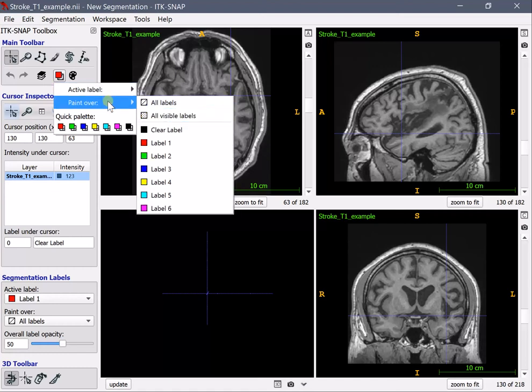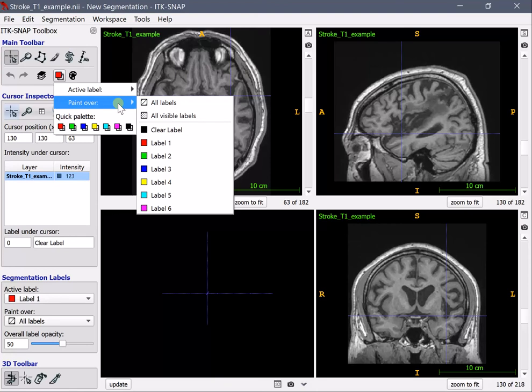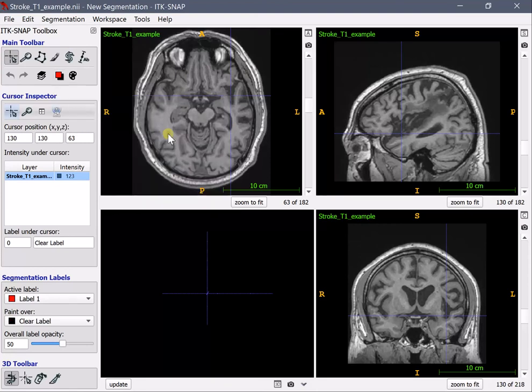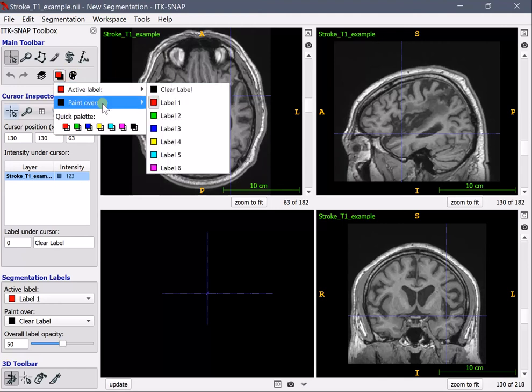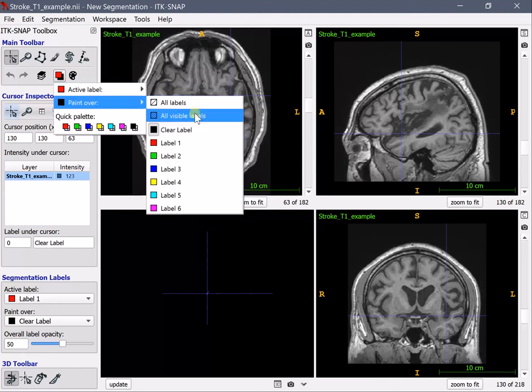The background or the paint over label is very helpful if you do more complex segmentations and allows you to select on which other value you're drawing. For example normally we draw on simply on label 0 and you can select clear label.